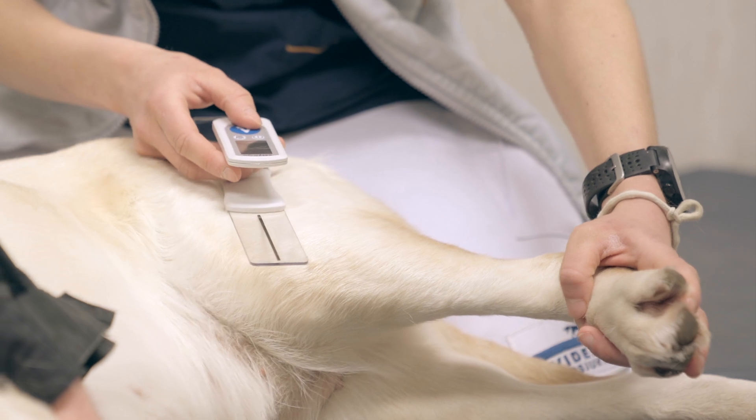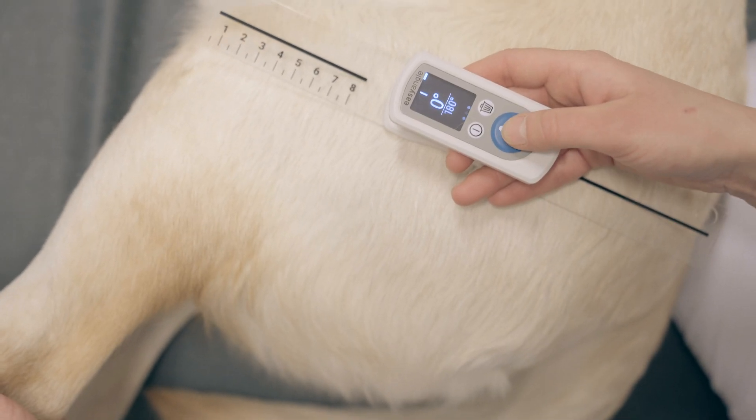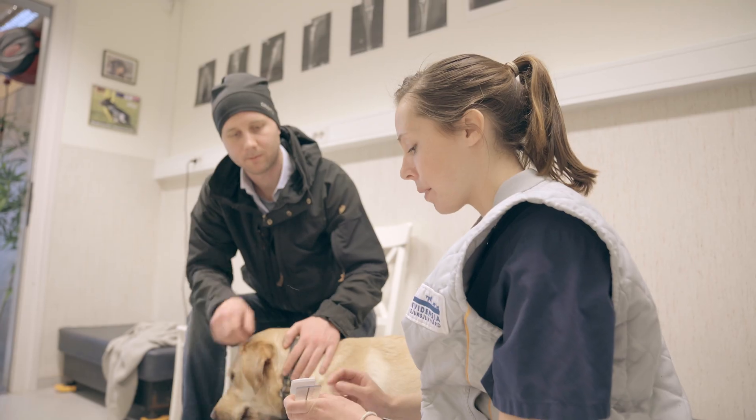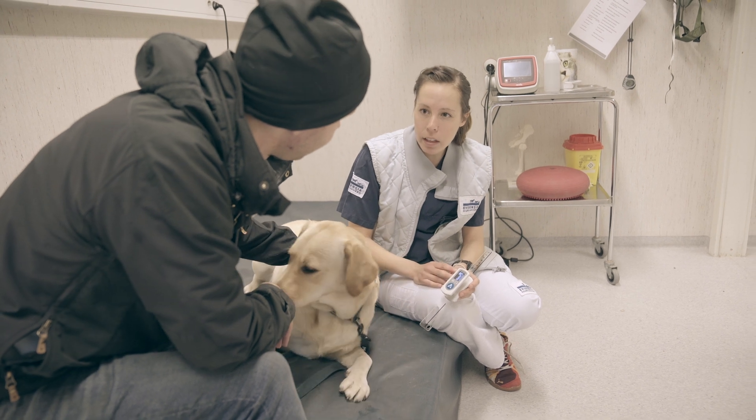Easy Angle keeps a hand free to support the animal. The measurement shows on screen after just two simple clicks. This reduces the need for anesthetization while quickly providing the relevant measurement.